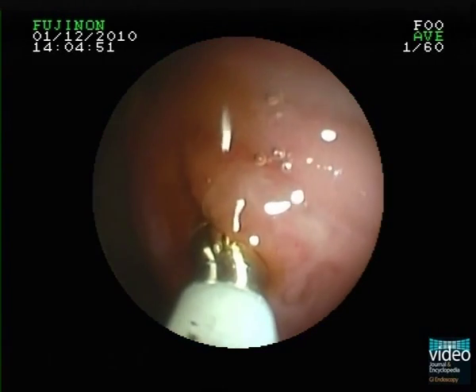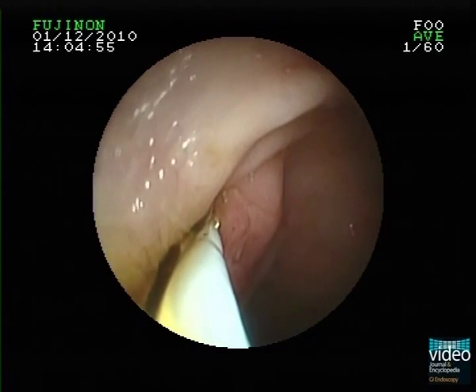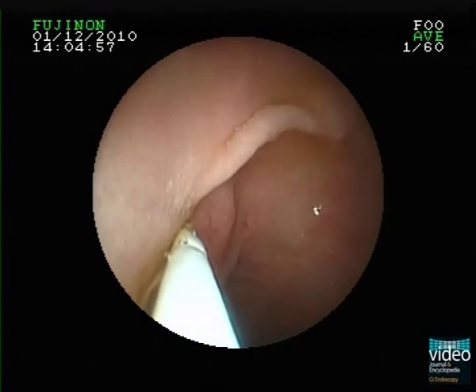The ultraslim endoscope is already positioned flush with the papilla, and we notice a juxta-ampullary diverticulum sitting just above.